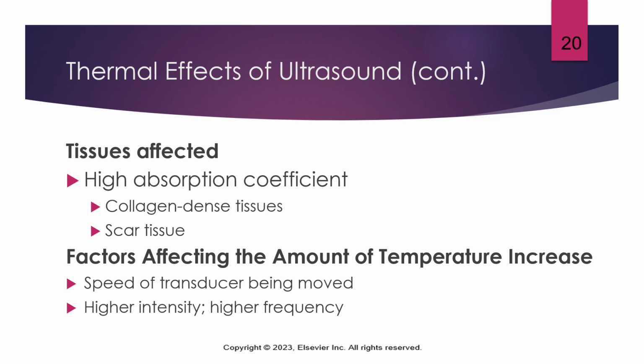The only thing that is a little tricky is that you can't use it on every scar that you see. We'll look at the contraindications later, but if somebody's had some type of surgical intervention like a total joint replacement, we really want to stay away from those areas with thermal ultrasound. And again, we'll talk about why we want to stay away from those here in just a little bit.